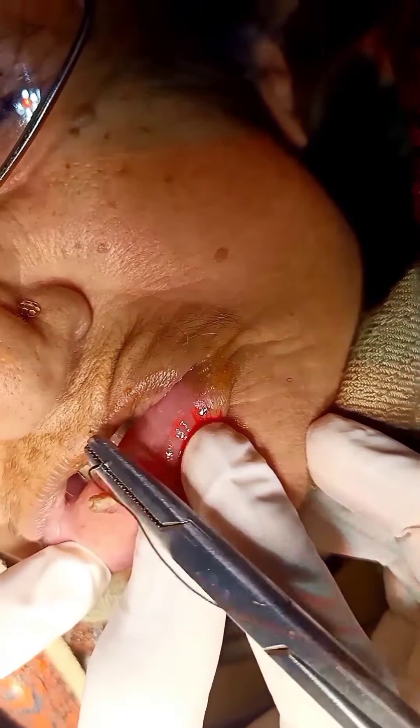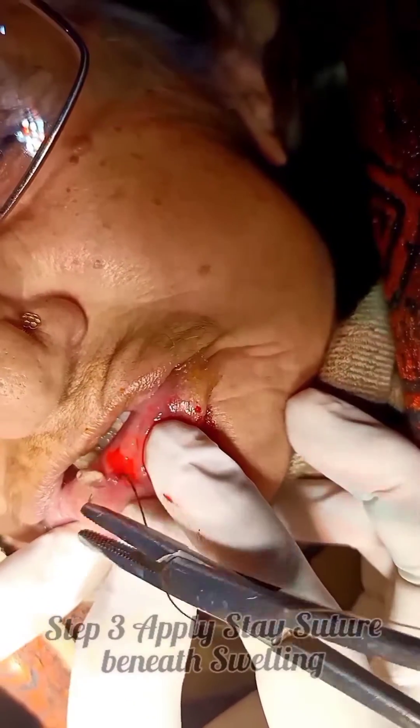On the screen, we are placing the suture underneath the swelling, so that when we excise the pyogenic granuloma, the bleeding issue is not there. One thing to mention: this video is made with the permission of the patient, so that no ethical issues of privacy and confidentiality occur.